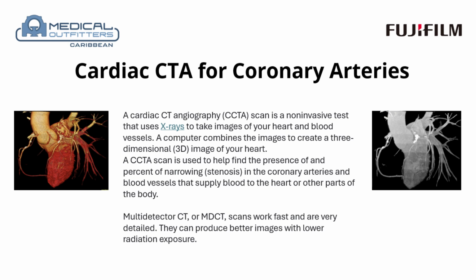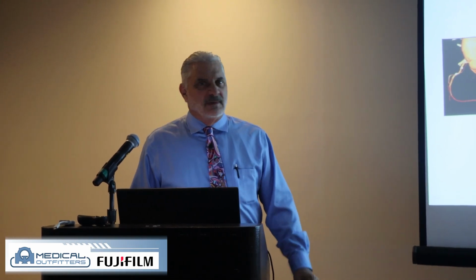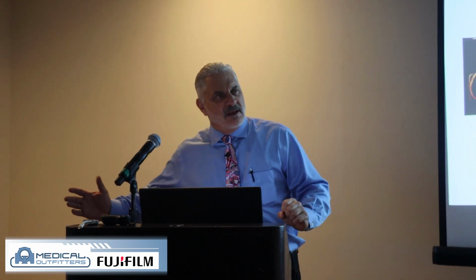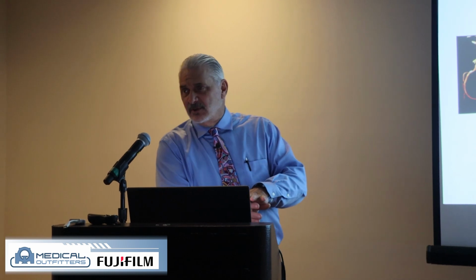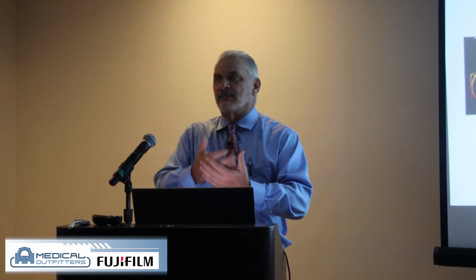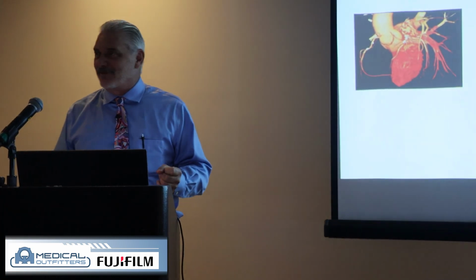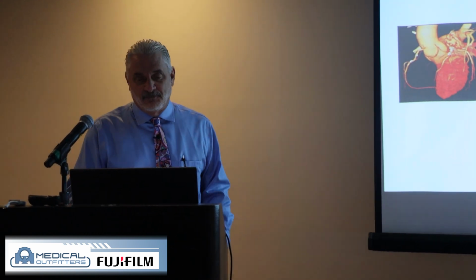I love doing this. I've been doing this since 1999 on an electron beam CT scanner in Miami Beach. It was the fastest CT scanner of the time. They moved to a 4-slice, 6-slice. GE bought the Imatron company that made electron beam. And then as we keep gradually getting faster and faster, we get that temporal resolution that radiologists look for, right? And a 0.35 rotation, which gives us the best image quality that we could ask for.